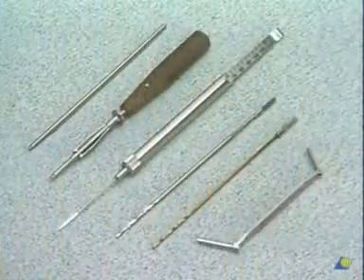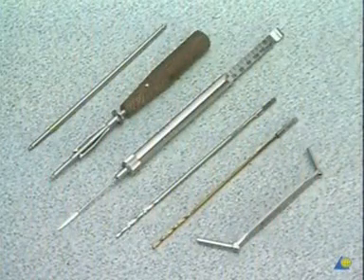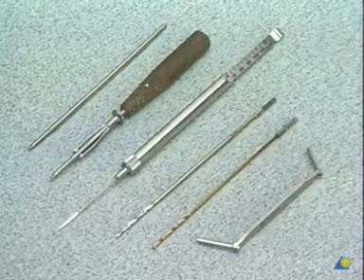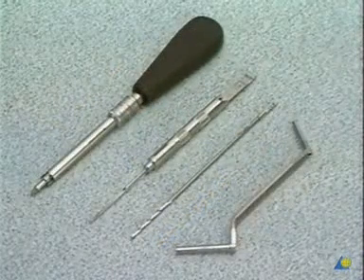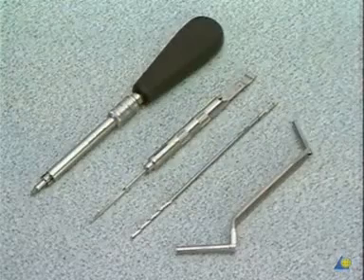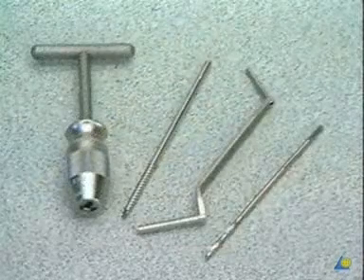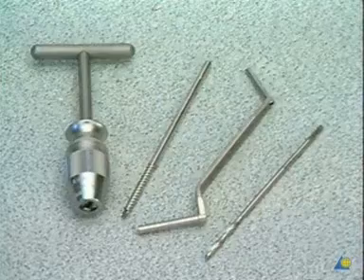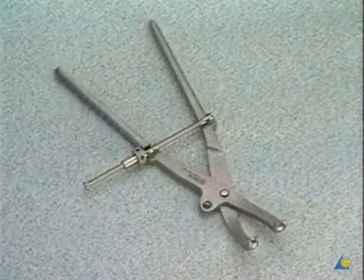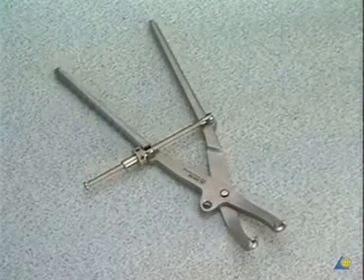For this exercise, we'll use part of the 3.5 instrument set and this selection from the 4.5 set. These are the instruments used for the insertion of the 6 mm Schanz screw. Also needed is this pelvic reduction forceps used with screws.